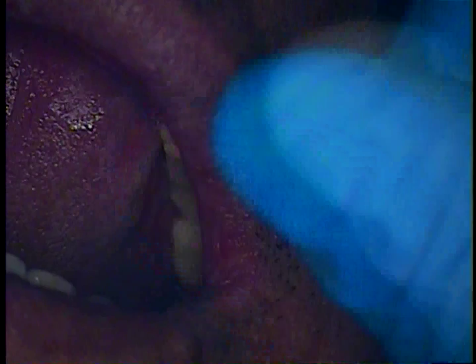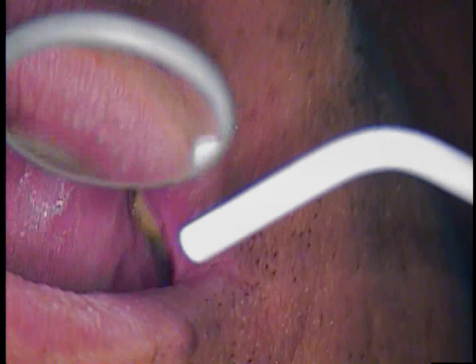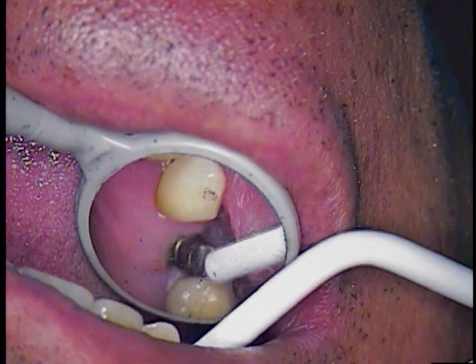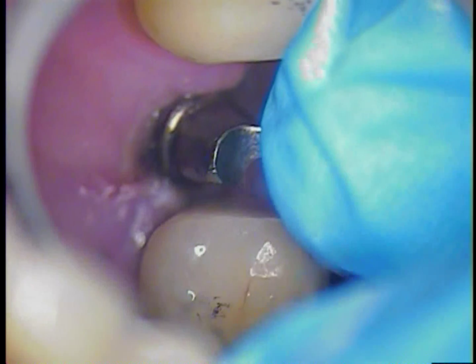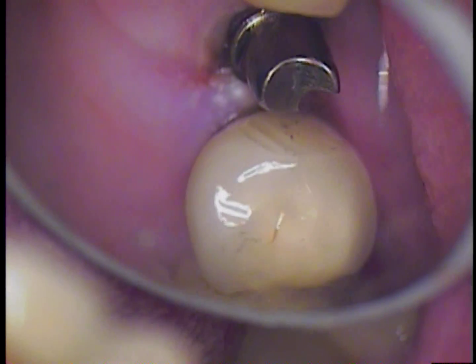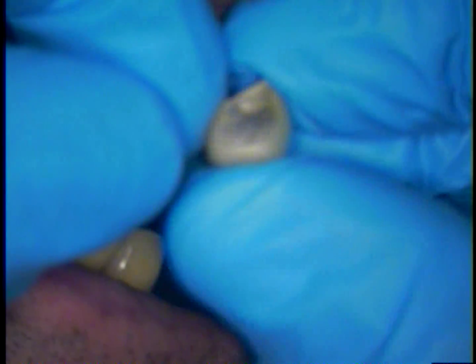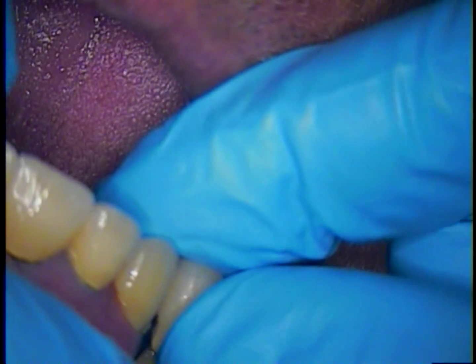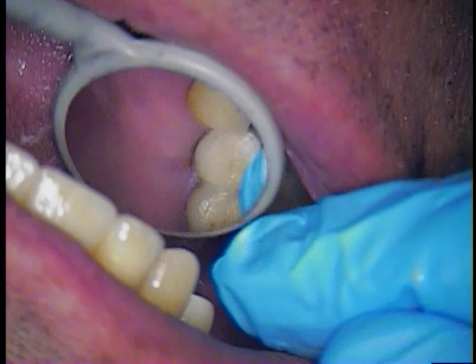I did have to adjust the distal aspect of the abutment — it wasn't much, but it was enough to allow the crown to slip in and to seat properly. The margins are definitely sealed. Now what you are seeing is the crown itself. The distal aspect was adjusted slightly, and I used a dark pencil for that.